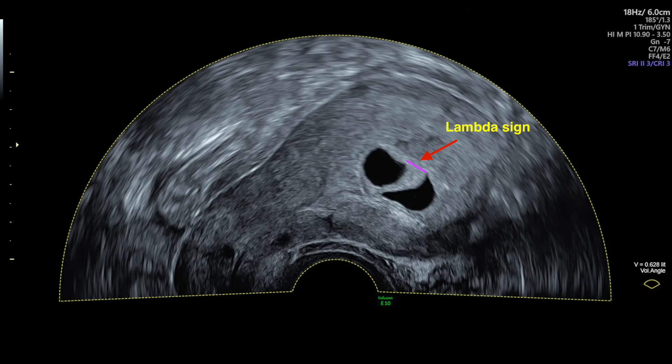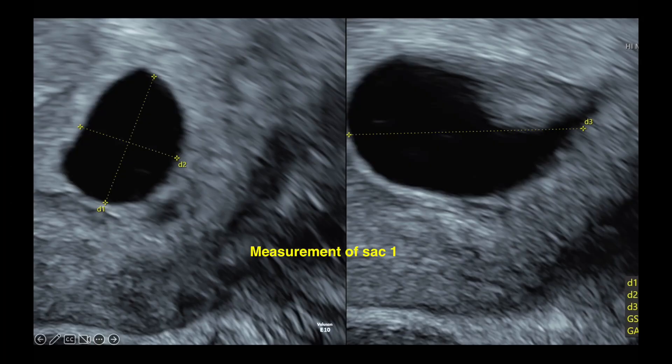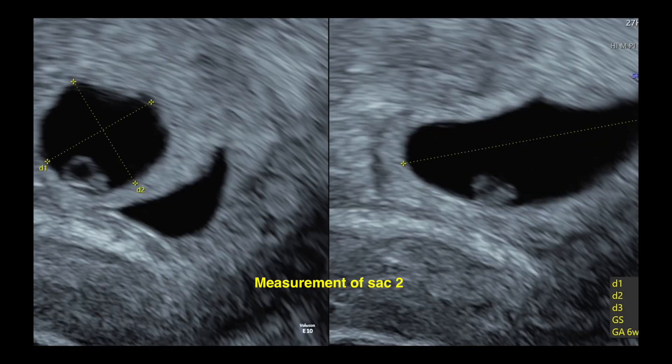In our case, this is the thick septum in between, suggestive of dichorionic pregnancy. This picture shows the measurement of gestational sac 1 in three dimensions — D1, D2, and D3 — giving us the mean sac diameter. This is the measurement of gestational sac number 2 in three planes.